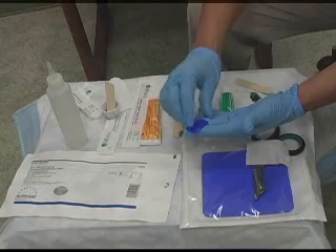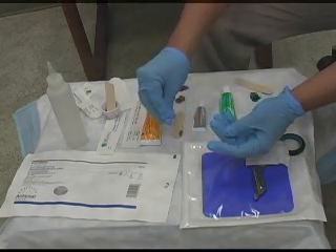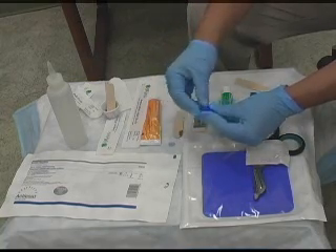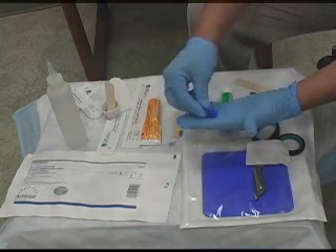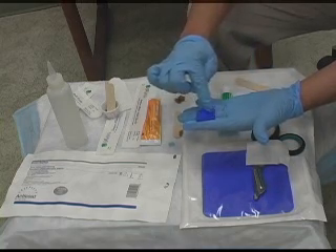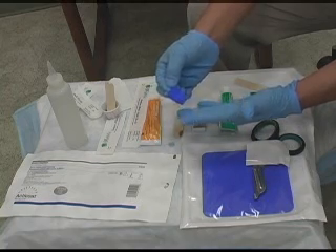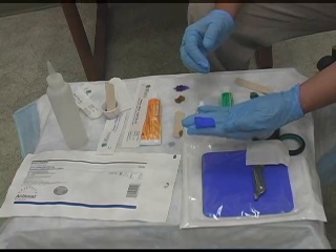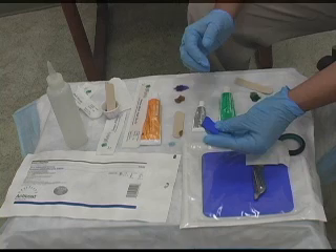Once you soak it down with normal saline, give it about 10 seconds for it to soak through. Then you want to squeeze the excess water out of it. You don't want it too wet, but you don't want it too dry. The way this blue works — as it's drying on the wound bed, it'll start turning white. When you pull it off, you've actually debrided the wound bed. This material has been known to kill, I believe, 98% of bacteria, including MRSA and Pseudomonas.